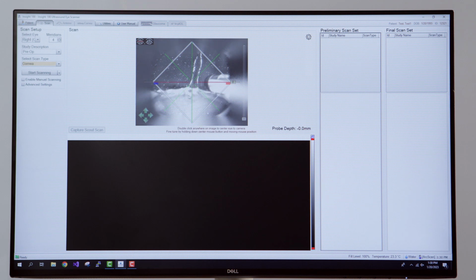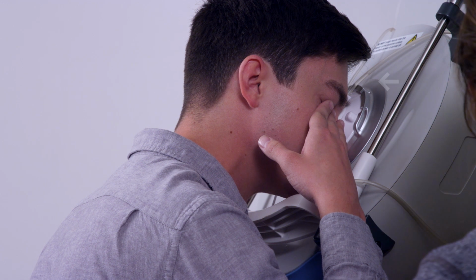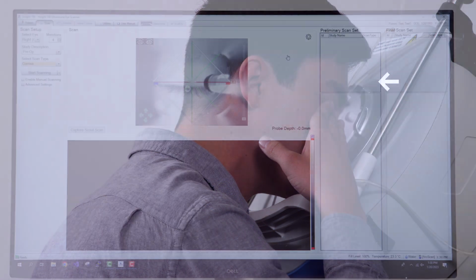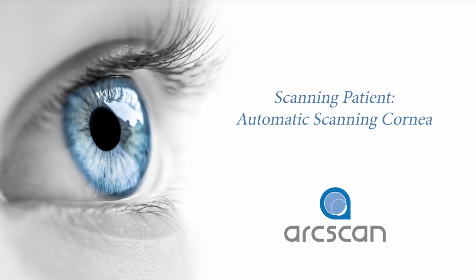When you see the saline begin filling, draw your attention to this upper tube. Close the line when the saline reaches the edge of this metal ring. Allow the patient 5 to 10 seconds to acclimate, then instruct them to open their eye and find the fixation light, which is now changed to look more like a full moon. The optics have changed for you too, and you may want to change the camera brightness.